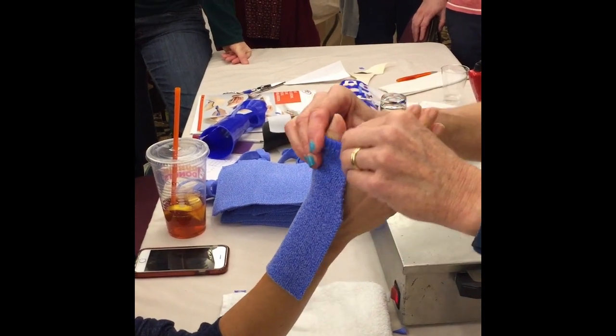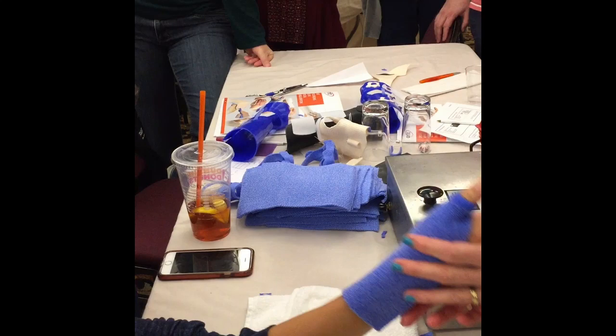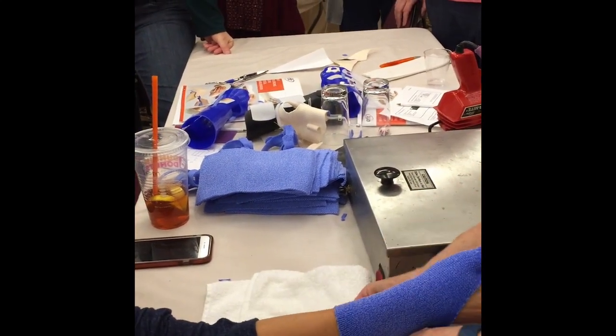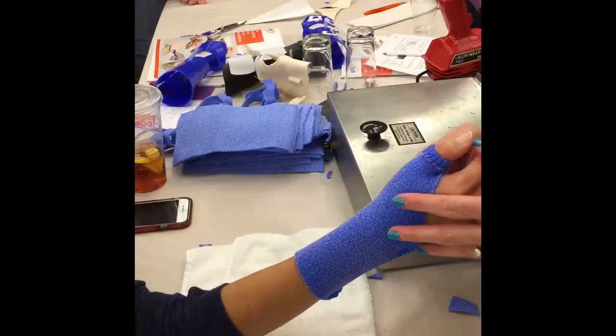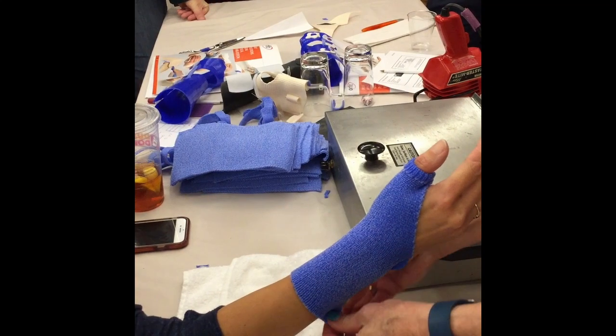We'll wrap it around here to anchor it. Set below, and then just bring your hand down here. Stretch — anchor one, anchor two, maybe one more anchor. I'm just anchoring it here to get that conformability, but I'm not going to keep it closed.